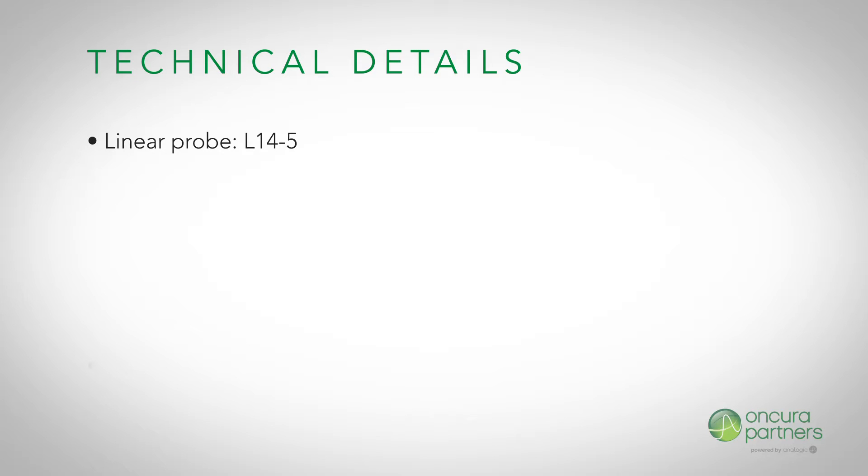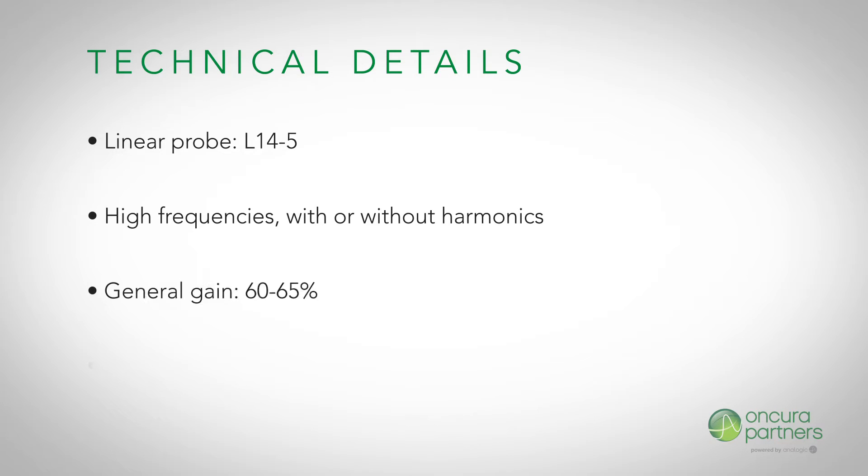A linear transducer with 3 to 4 centimeter depth will provide the best image. Utilize high frequencies with or without harmonics. The general gain should be maintained at approximately 60 to 65%. Select the third or fourth TGC curve from the drop-down menu.